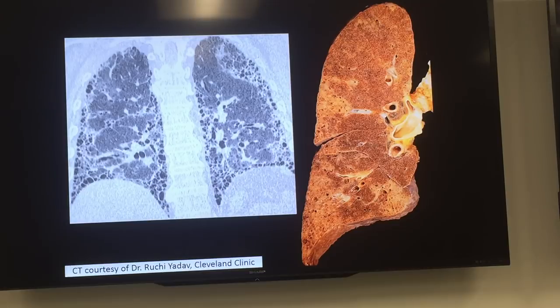And then here's what all of you have seen, at least the ones who have been through lung have seen. This is what it looks like on the gross specimen, which correlates with the microscopic, right? Now interestingly, you can see fibrosis here and you can even see some honeycomb change grossly. Everybody sees it. Now interestingly, if you sample those areas that look normal, often there's fibrosis microscopically. So at every level, the microscope is better than radiology or gross. Things that look normal on radiology can be fibrotic microscopically. Things that look like they have no honeycombing on radiology can have honeycombing microscopically.